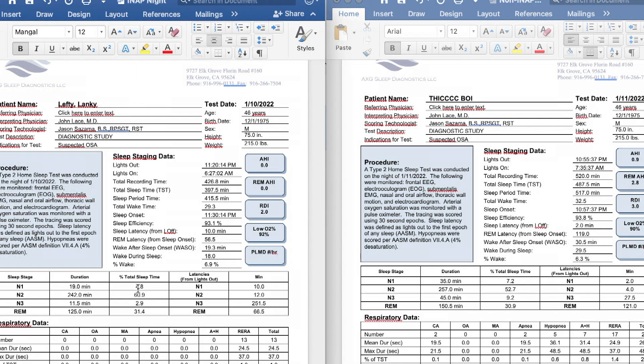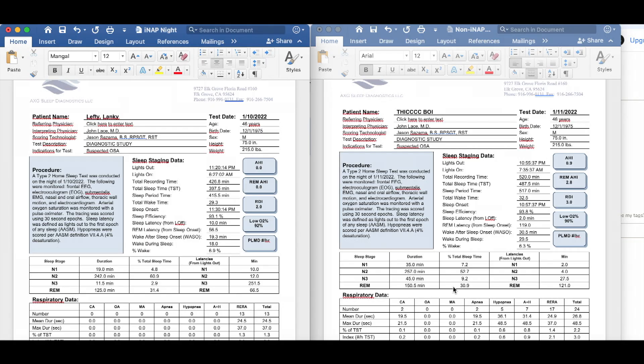We have a ton of similarity on both nights. Looking at Stage N1, we have 4.8% versus 7.2% on the baseline night with no iNap. N2 sleep, Stage 2, we have basically 61% versus 53%. Stage 3, slow-wave sleep: 3% versus about 9%. Then we have REM sleep at 31.4% and 30.9% — really, really close, pretty much across the board. Pretty impressive.